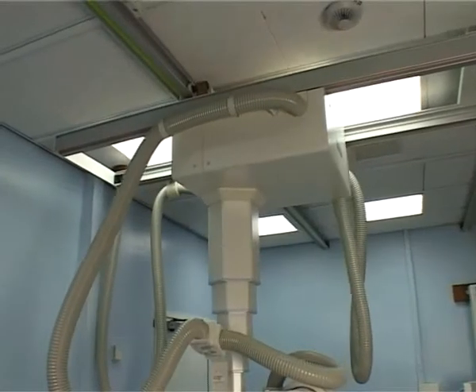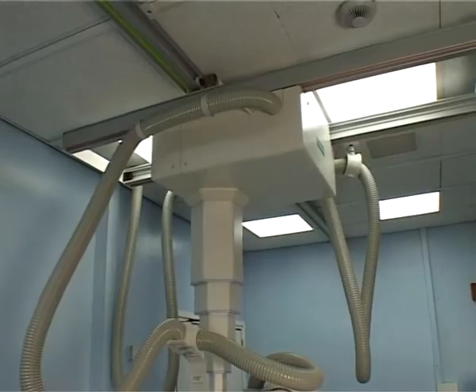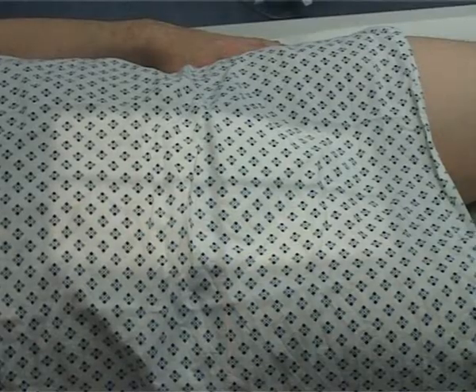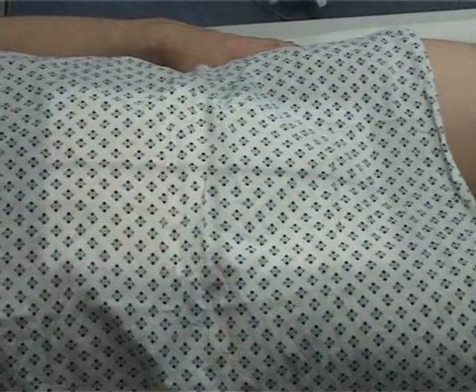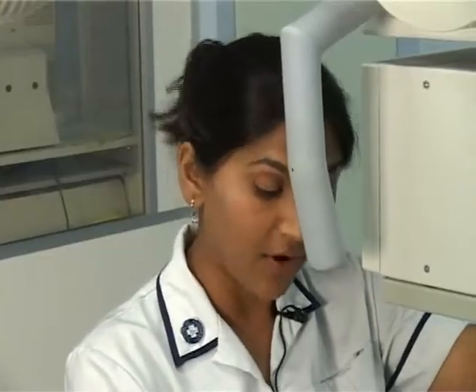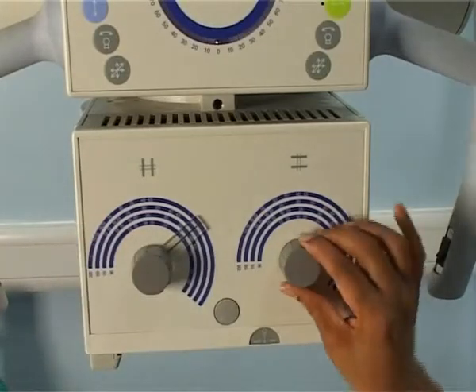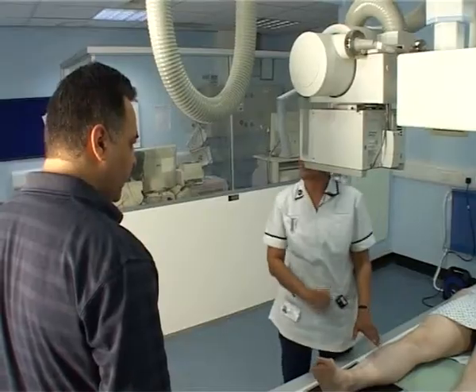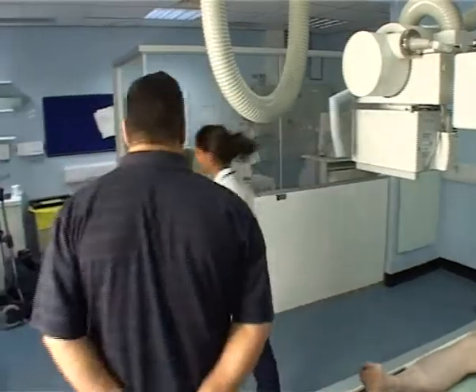So it really can move the machine in any direction. We also have it ceiling suspended so there's nothing that will stop it turning all the way around. This is what we call the box that has the light beam in it. We have a button that will put on the light which will tell us where to look, to position the area of interest. And we have a cross which we use to centre to the area of interest. We have two buttons which will control the size of the beam of the x-ray, so we only x-ray the area of interest and we don't irradiate any other part of the body that's not necessary. And we're ready to do the x-ray, so we can go behind the control panel and set the exposure.